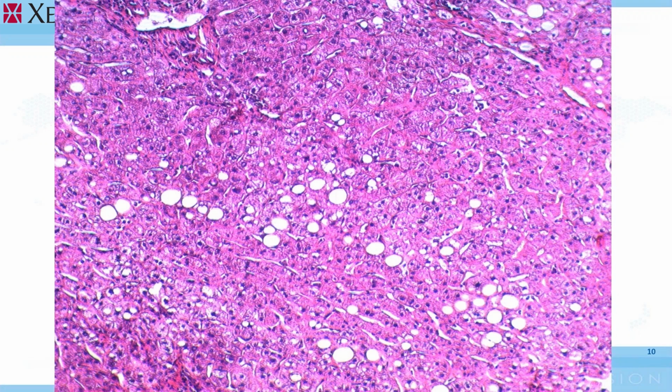As you can imagine, other parts of the body than the liver may be burdened with the fat load. The microvesicular fat is also present. Since we have an individual without history of alcohol use, we can think about non-alcoholic steatohepatitis. Diagnostic criteria for NASH, non-alcoholic steatohepatitis, include the following three.